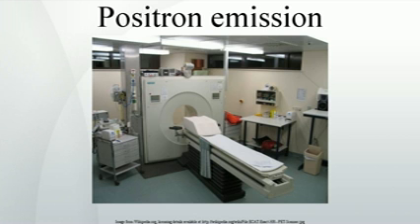Musculoskeletal imaging. PET has been shown to be a feasible technique for studying skeletal muscles during exercises like walking. One of the main advantages of using PET is that it can also provide muscle activation data about deeper-lying muscles such as the vastus intermedialis and the gluteus minimus, as compared to other muscle studying techniques like electromyography, which can be used only on superficial muscles, that is, directly under the skin.